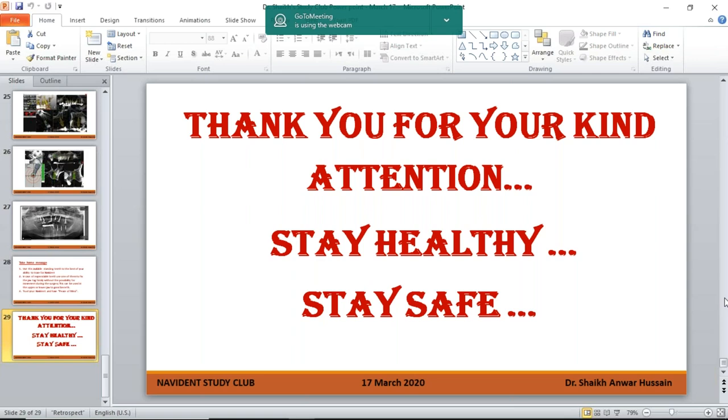In fact, I do have one question from Dr. Lapeche asking why you are not using the head tracker. You showed us the case where you actually fixed the jaw tracker, the tag which is used to track patient movement, but usually, generally speaking, is used for the mandible, and not using the head tracker, which is the goggles that are fixed on the nose with the tracker on the forehead. Your decision was to use the jaw tracker instead of a head tracker. Can you explain the rationale for that?